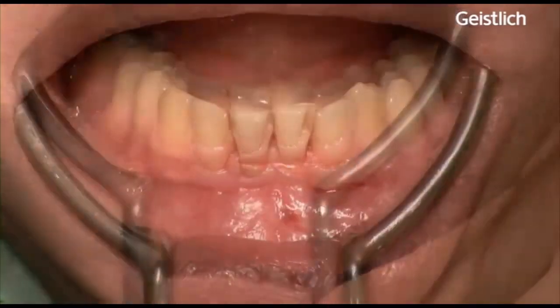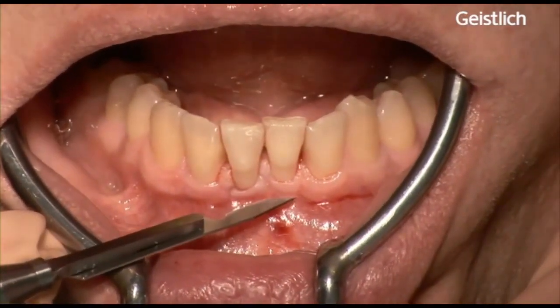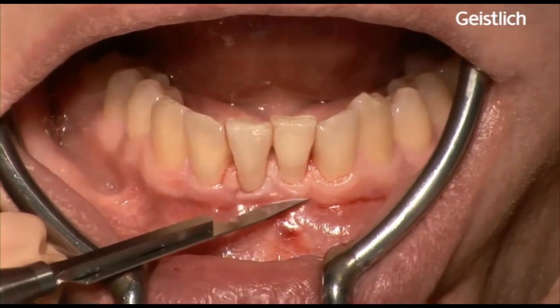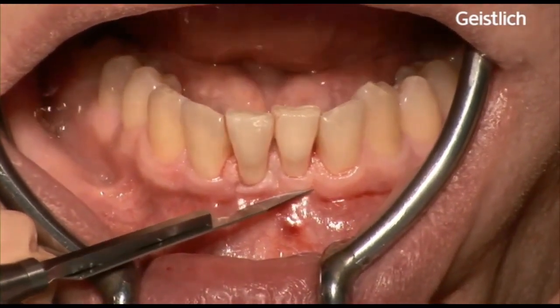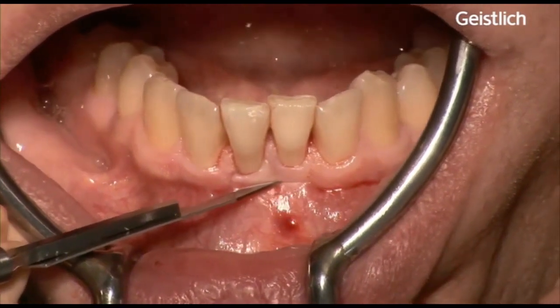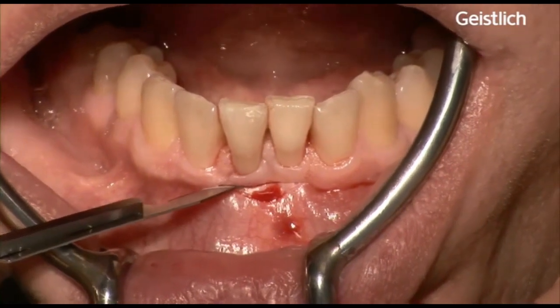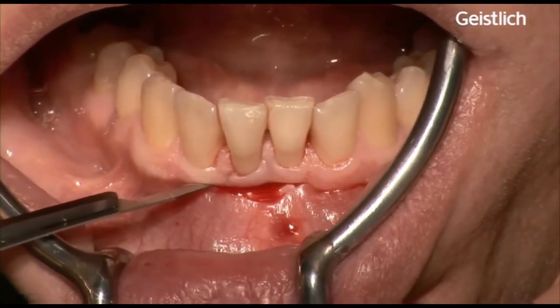Following administration of local anesthesia with articaine, the surgery starts with a horizontal incision just beyond the mucogingival junction. It is important that a minimal band of keratinized tissue is present in the treated site or in the surrounding tissues.